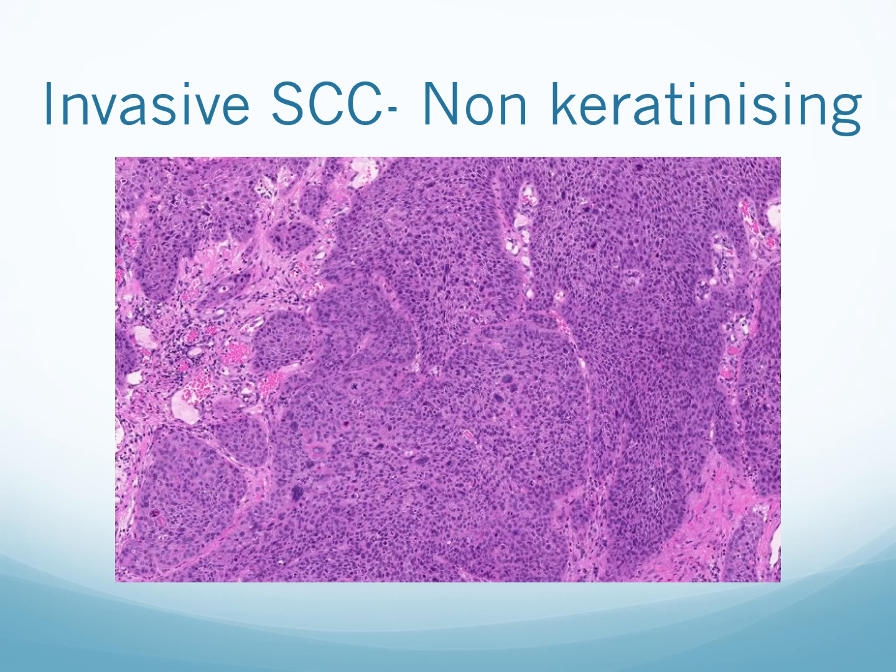Sometimes the cells don't mature in their little nests and form keratin, and they remain this dark blue color resembling CIN3. This is a non-keratinizing squamous cell carcinoma. Both these squamous cell carcinomas will be related to HPV. Very few squamous cell carcinomas are not related to HPV.